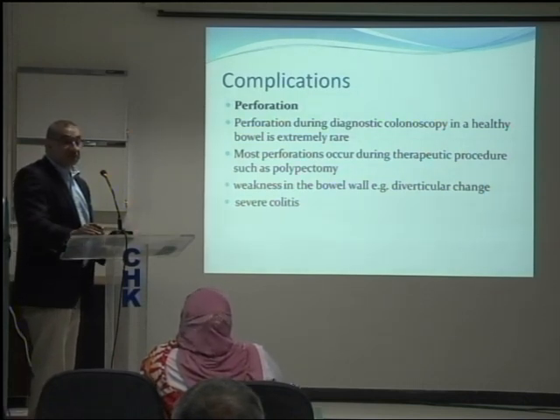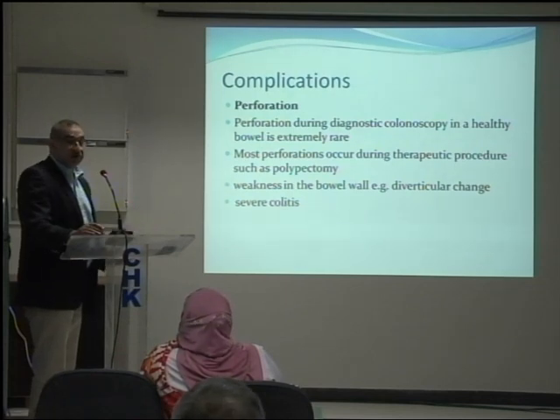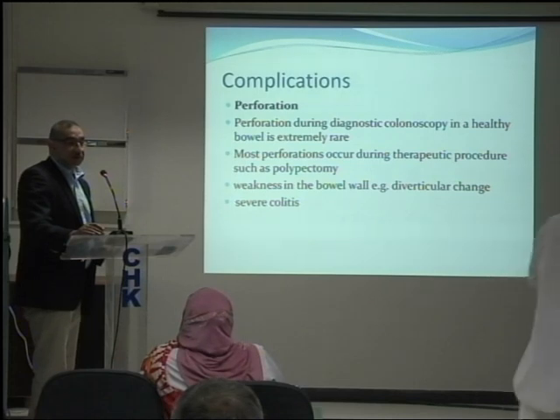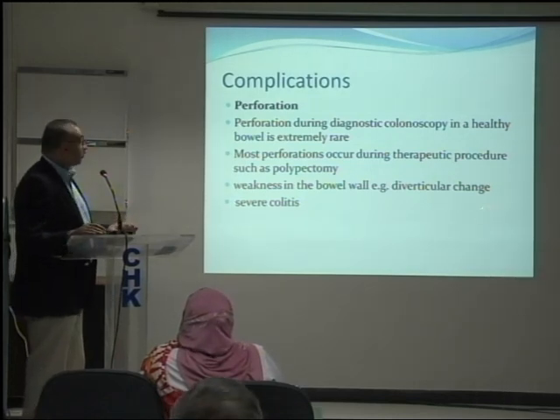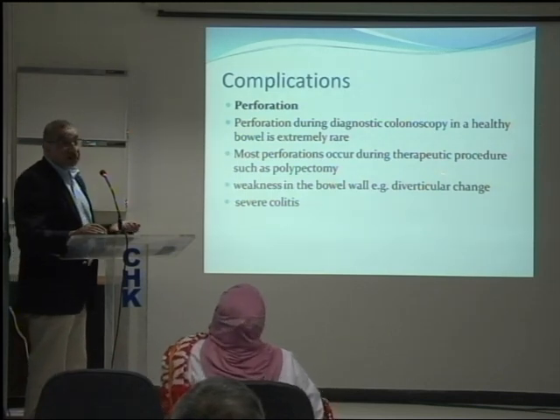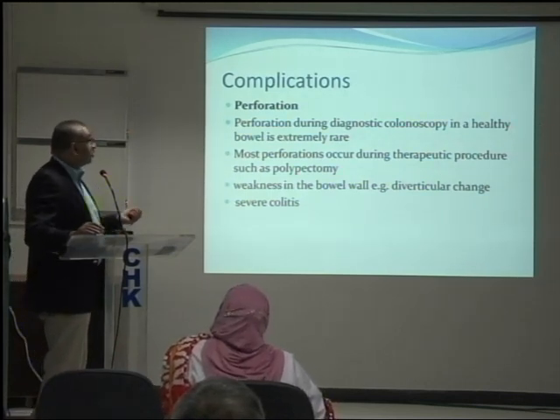I've seen people cause perforation in a diagnostic procedure because their technique is bad, they are rough, and they cause tears of the mesentery or they cause tear of the colonic wall. So that should never happen in a diagnostic healthy colon.